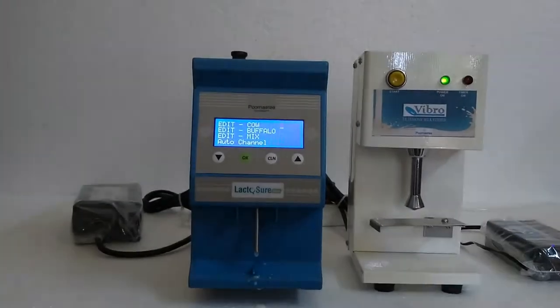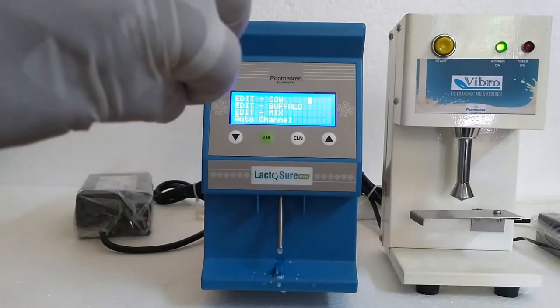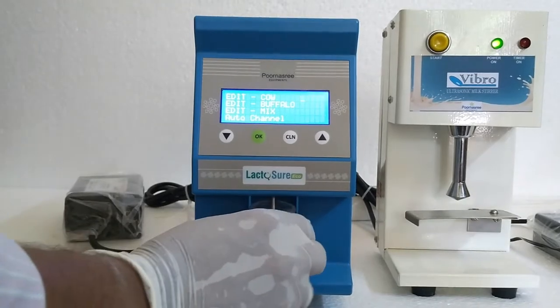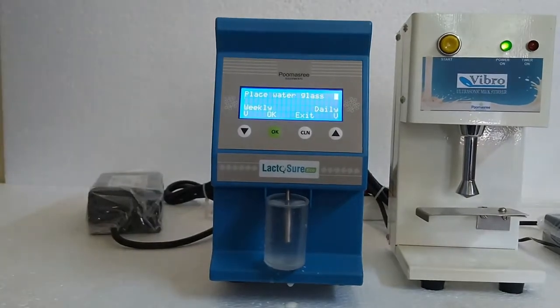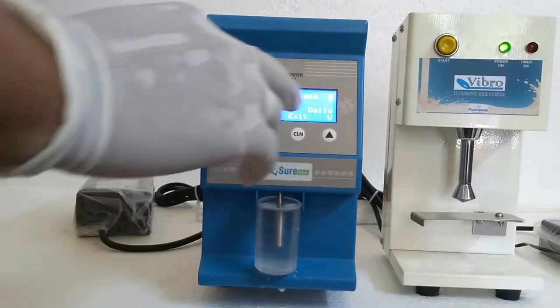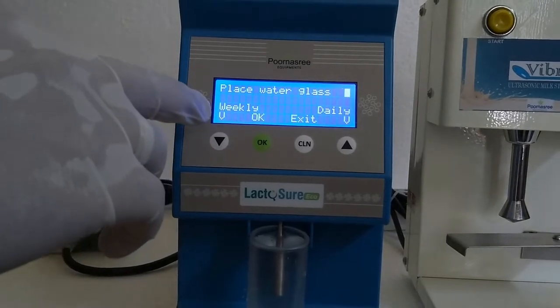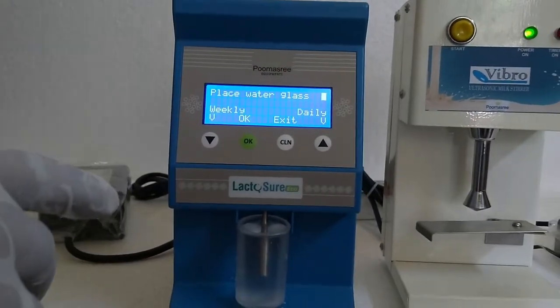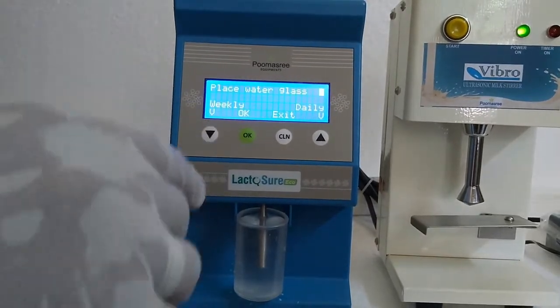Now let us see how to clean the analyzer. Take 20 ml of water inside the bottle and place it here, then press the clean button. The screen shows two types of cleaning: one is weekly and another is daily. For daily cleaning we use alkaline solution, and for weekly cleaning we use acid solution. Be careful when using acid, because it can damage the sensor. So we prefer alkaline solution for daily cleaning.